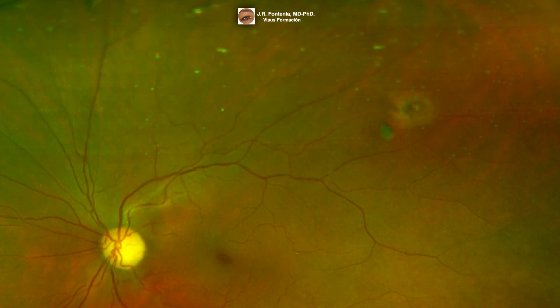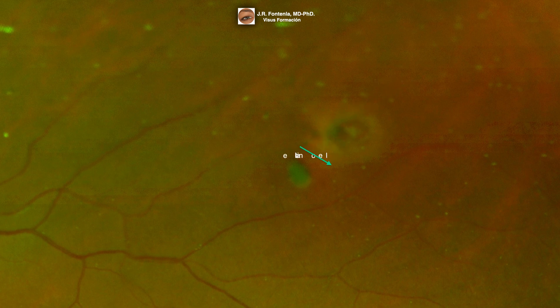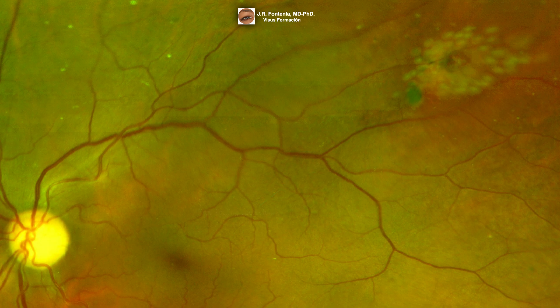Here we see another clinical case of peripheral retinal tears. Look at the retinal hole and a free-floating operculum. Here we can see it immediately after the laser treatment.